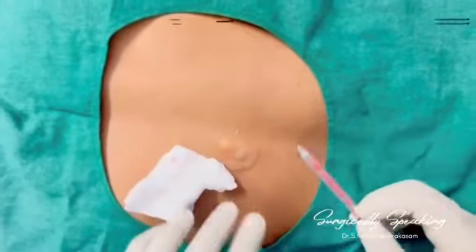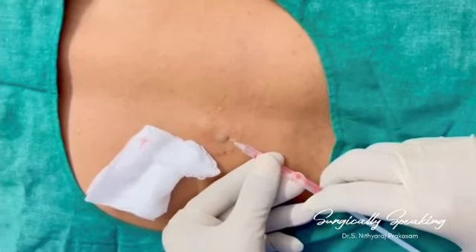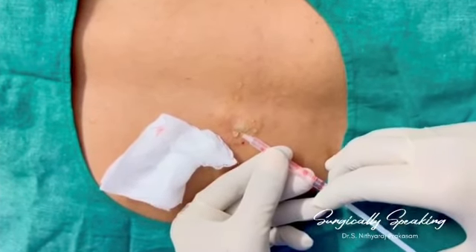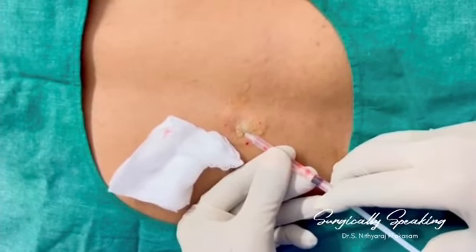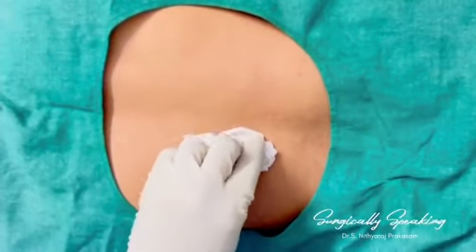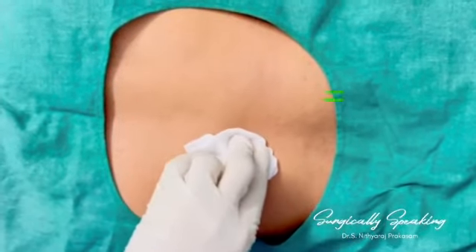And now I'm taking this insulin syringe for infiltration along the line of incision. This I try to infiltrate along the line of incision so that my skin flaps get raised easily, and it will also reduce the bleeding, and it will make elevation of the flaps easy.